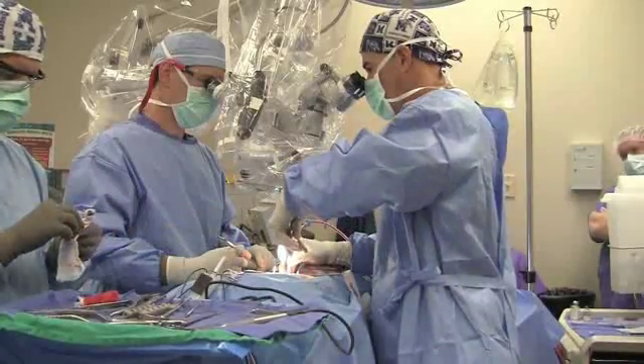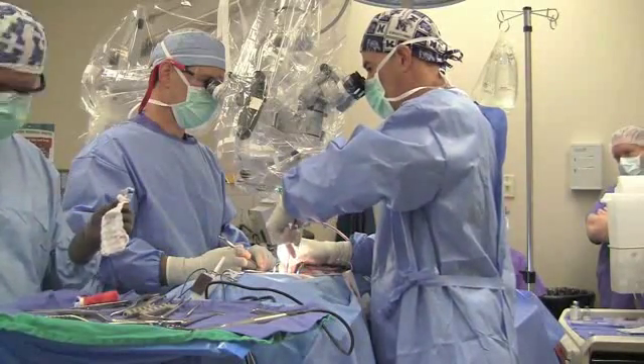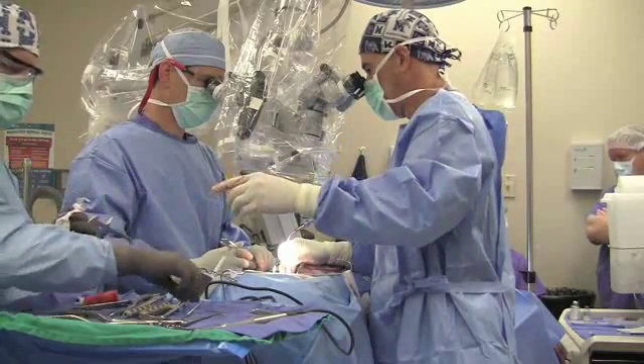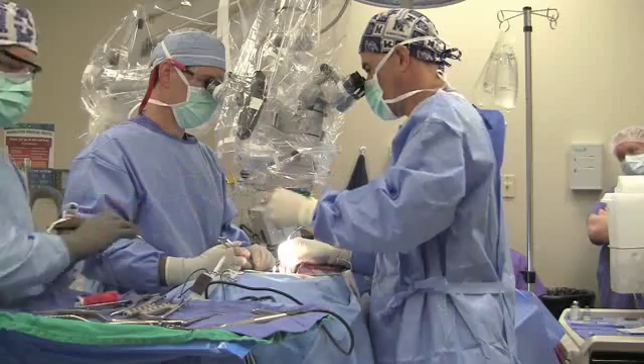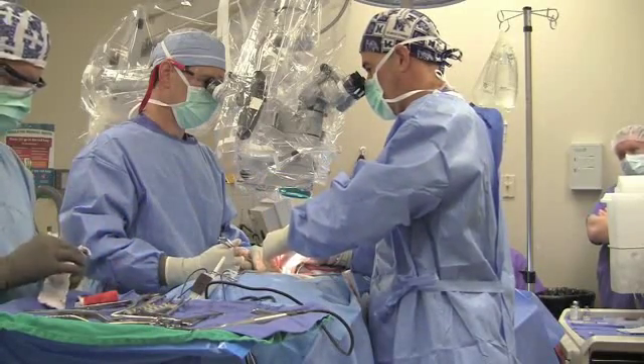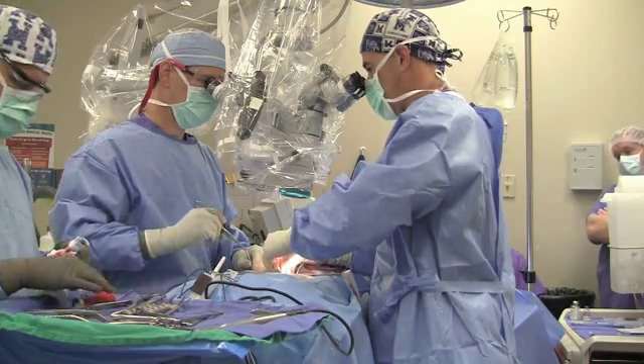Here we are, first starting the operation, taking the pressure off the nerve and removing any disc that would be pressing on the nerve to get rid of the leg pain. Following this, we'll perform the stabilization portion of the procedure. We're doing this part of the procedure under the microscope.